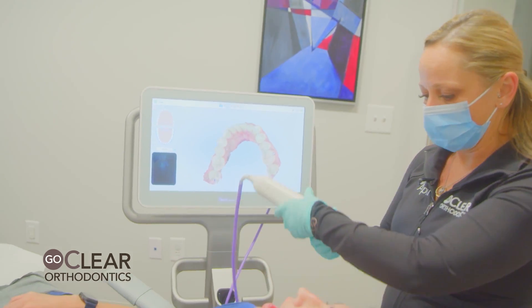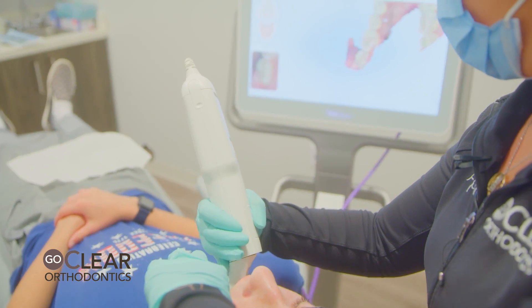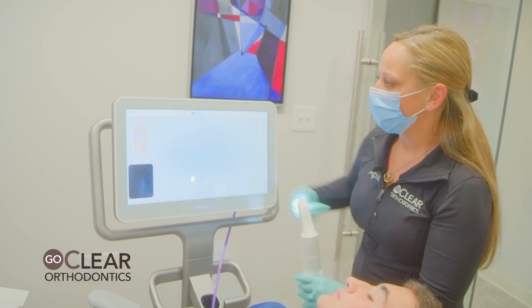Let's fill in this molar a little bit better. I'm going to roll in towards the tongue. Once you get it, stop. We have no blue spots, so we're going to go on to the upper arch.